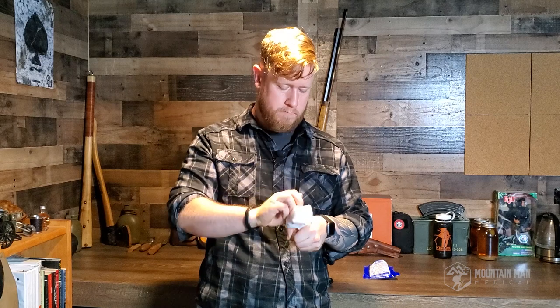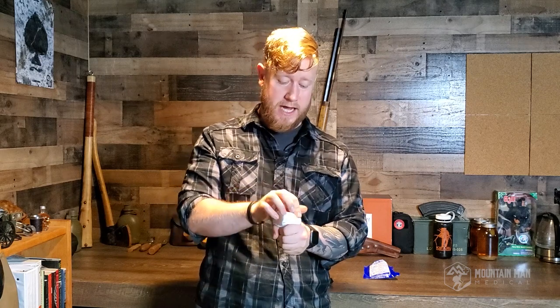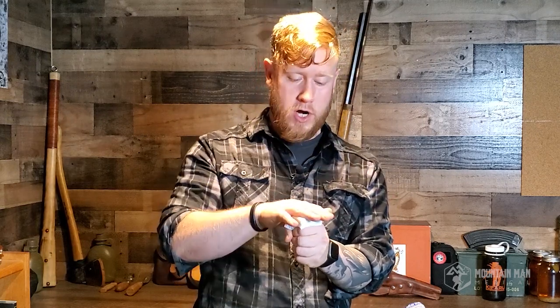You can see that this is a decent amount of gauze still, so that will also help to apply pressure over that wound. Once you get that pressure dressing in place, it's going to add a little extra pressure because of the smaller surface area. Take that gauze, put it on there, take your pressure dressing and wrap it around snug but not tight. Remember that a pressure dressing is not a tourniquet — it is a pressure dressing, it just applies pressure to the wound. If you need a tourniquet, use a tourniquet. Once you get that wrapped around and set in place, you're done.